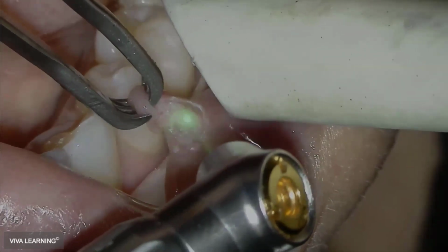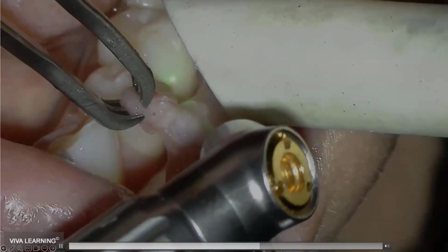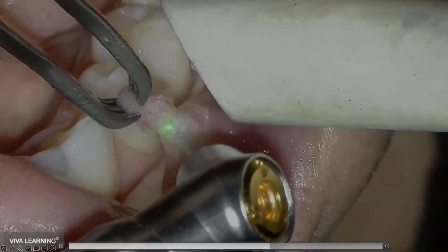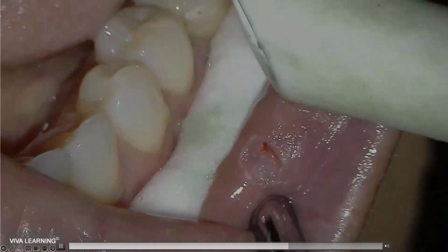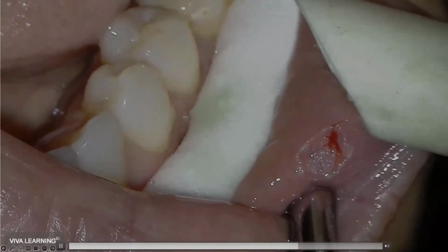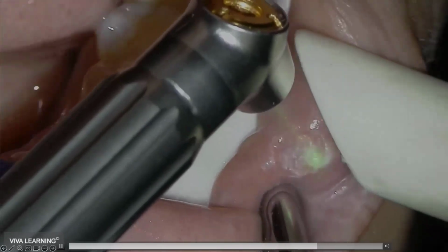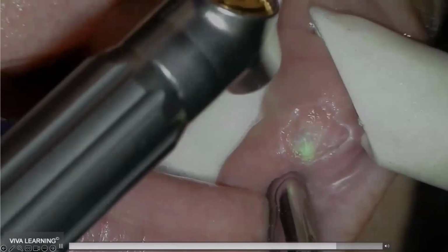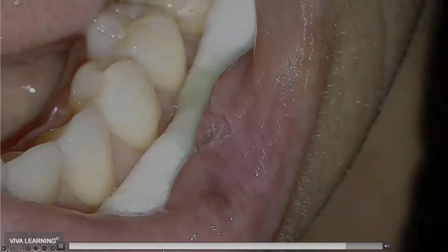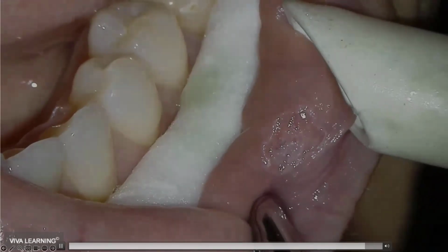One real quick question that came through: is there any odor from the cutting? Nice part is, there is none. It doesn't smell like you're burning tissue, especially because you're ablating tissue. Now, it was a bigger fibroma, so I got a little bit of bleeding there, and so I just paint back over with the laser and that mops that up and causes that coagulation to stop that.